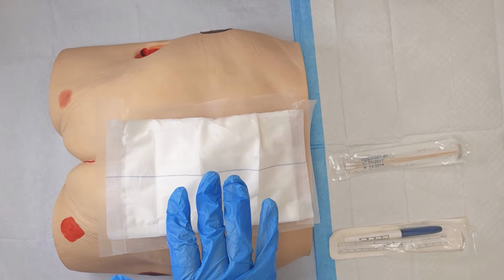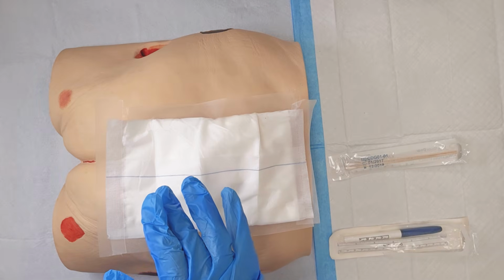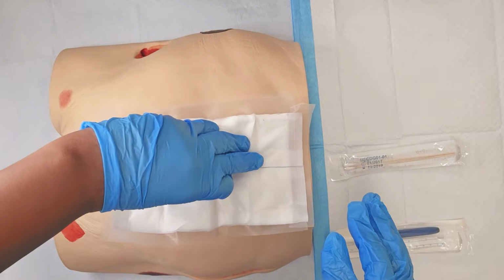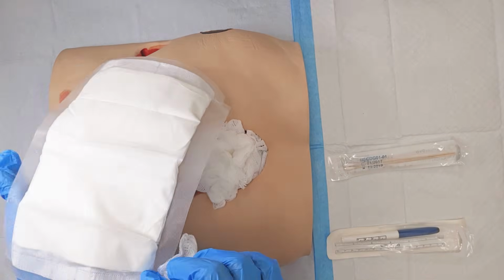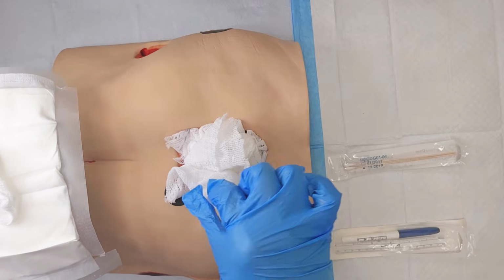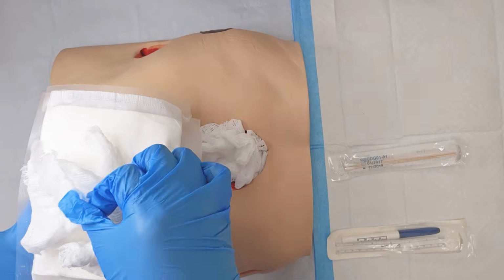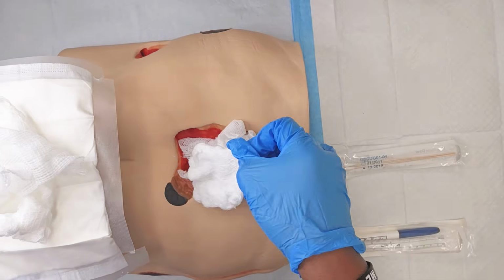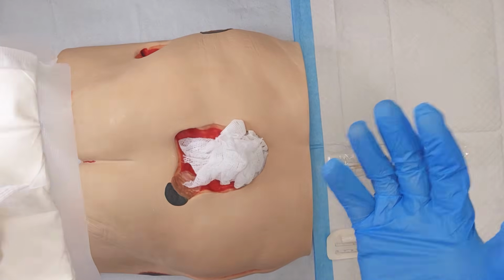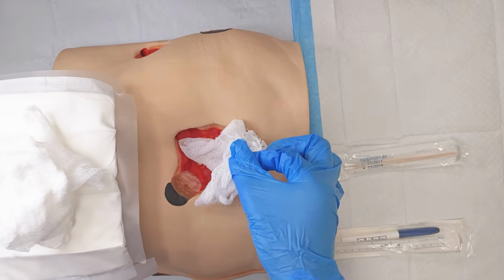Now, once that tape is removed, I can go ahead and then remove the actual outer dressing. So I'm removing that outer dressing, and as I'm removing the outer dressing, I come to the gauze that is used to pack the dressing, and I'm looking at the appearance of the gauze, noting any drainage, such as serosanguinous drainage, which is a mix of blood and clear drainage.